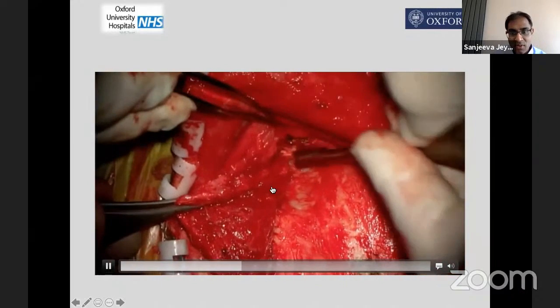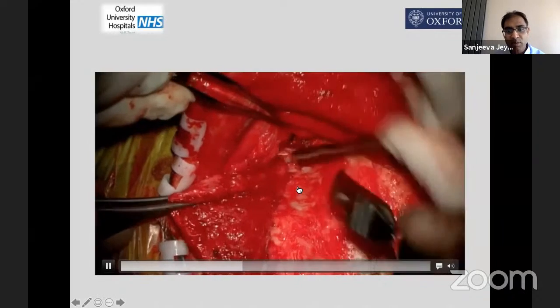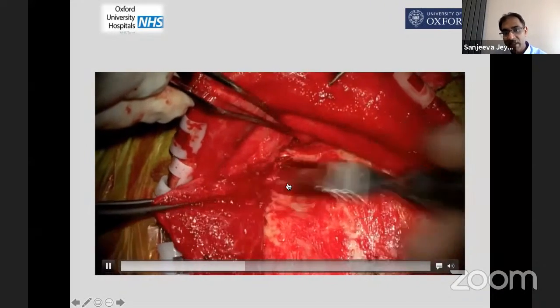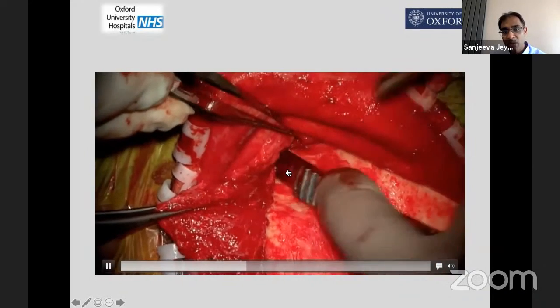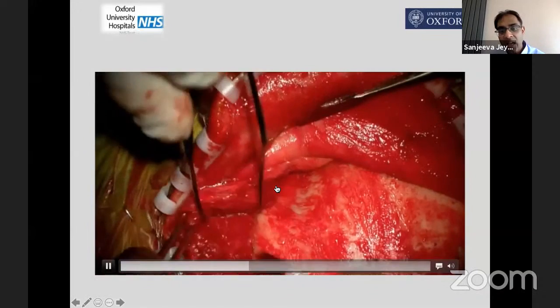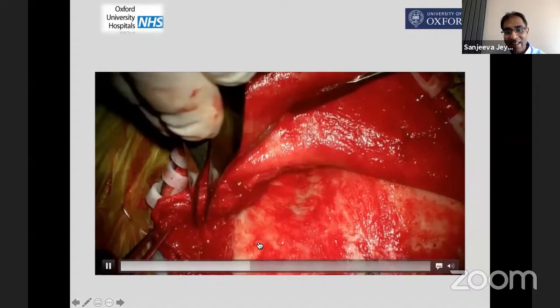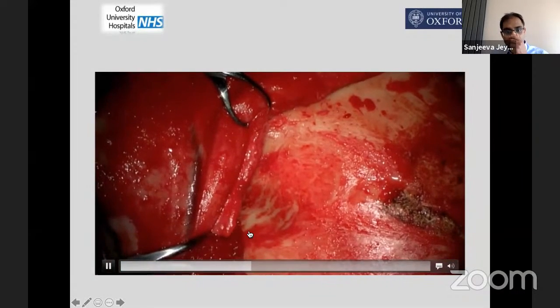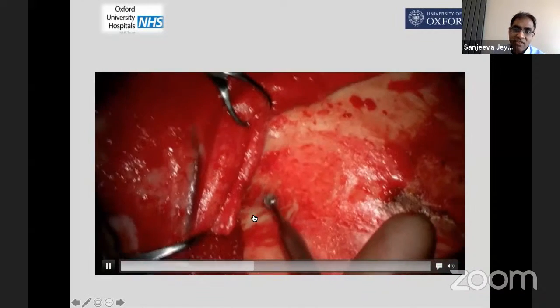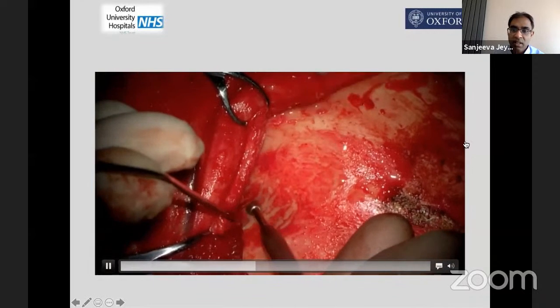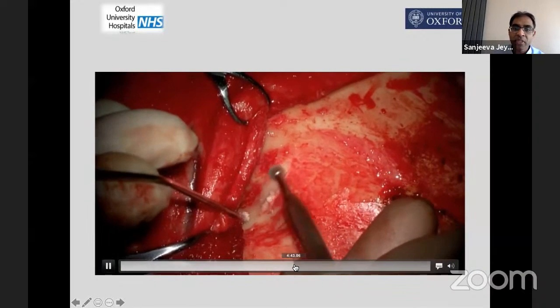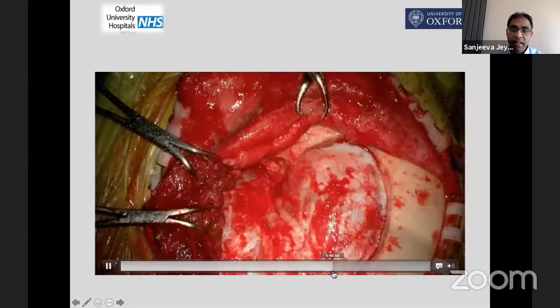Lifting off in a nice plane — I do something slightly different from others: I don't cut into the muscle at any point, though it's absolutely okay to do so. I disconnect along the sphenoid and take it right down and back. It's fine to leave a cuff and suture it back; I suture back onto bone plates. There's some bleeding at the back from the anastomosis between the middle meningeal and deep temporal arteries — you can use a bit of monopolar, but remember the deep temporal artery is coming from below and needs to be protected.